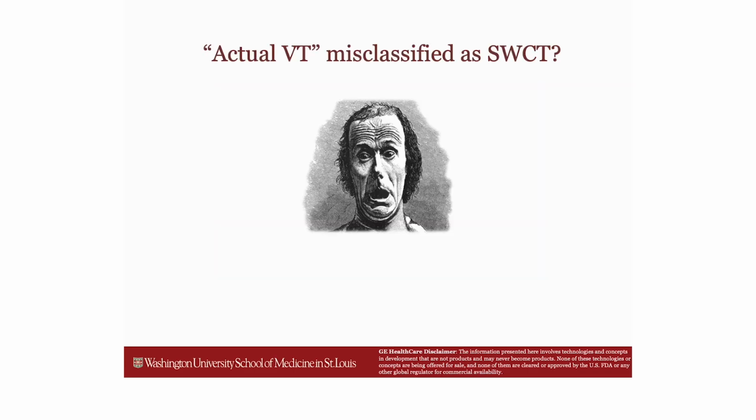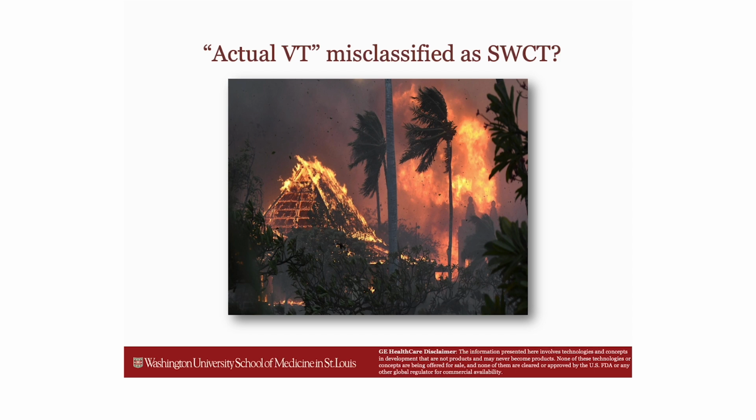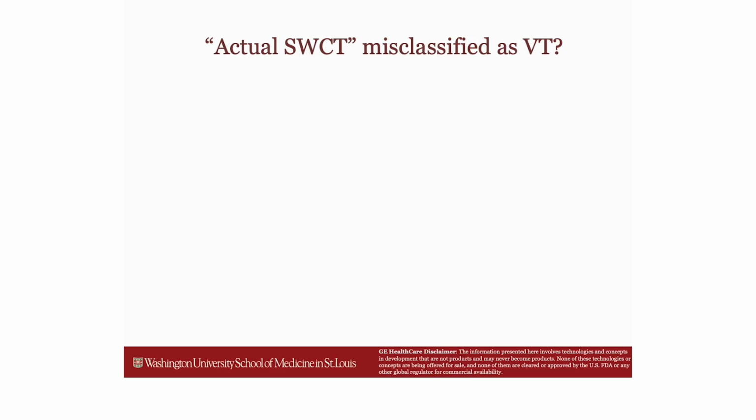Well, what about an actual VT misclassified as an SWCT? So this is definitely the most feared complication that we have in terms of wide complex tachycardias, and it can easily lead to medication administration that results in hemodynamic collapse of the patient. And basically, that's what I would categorize as a disaster. And it actually could be a disaster that leads to an unnecessary error that actually takes the life of a patient.